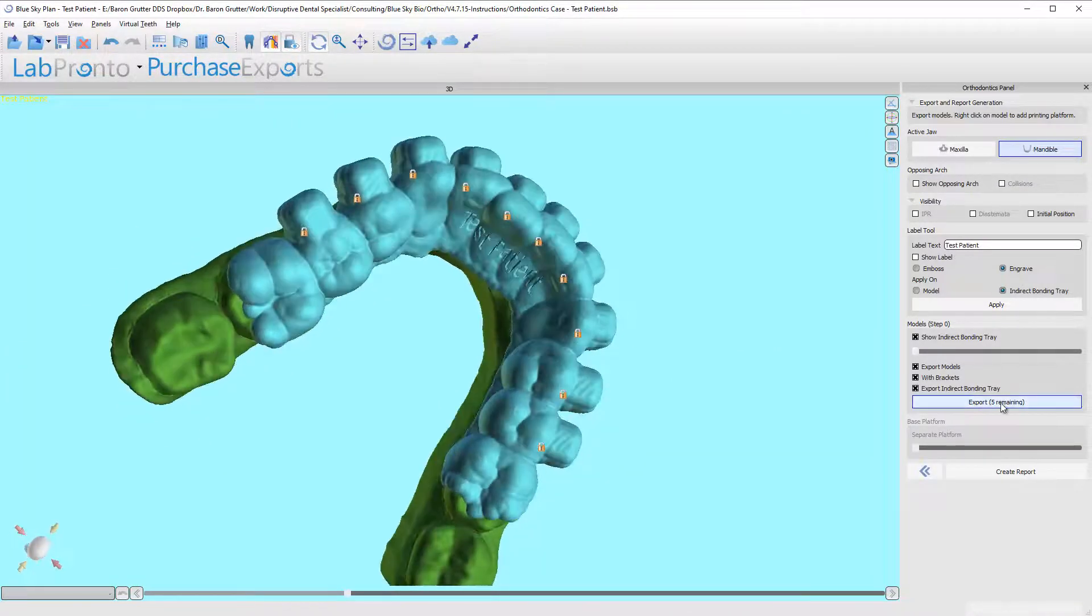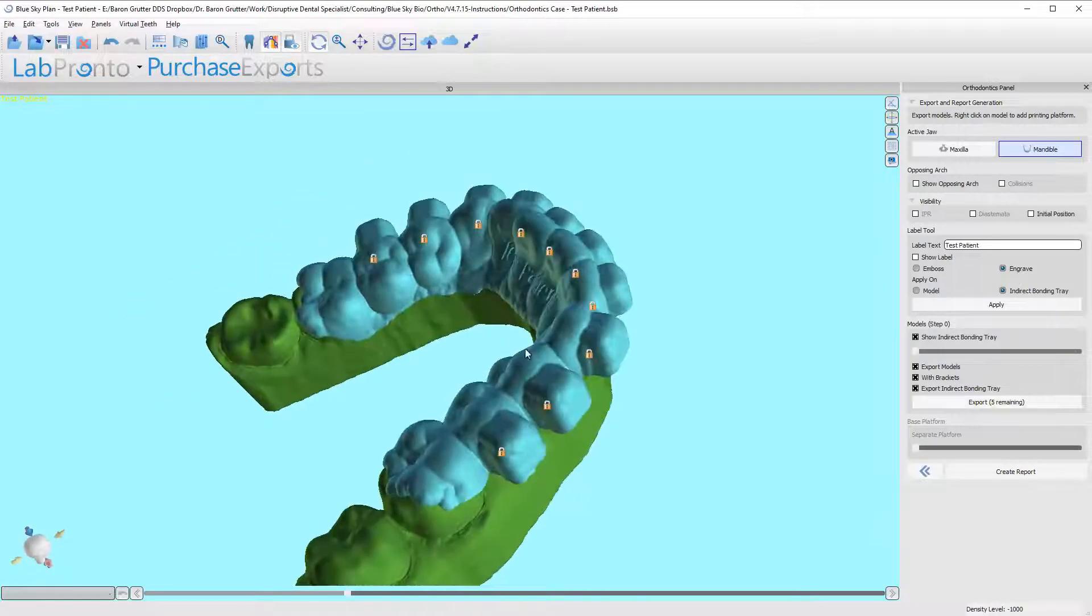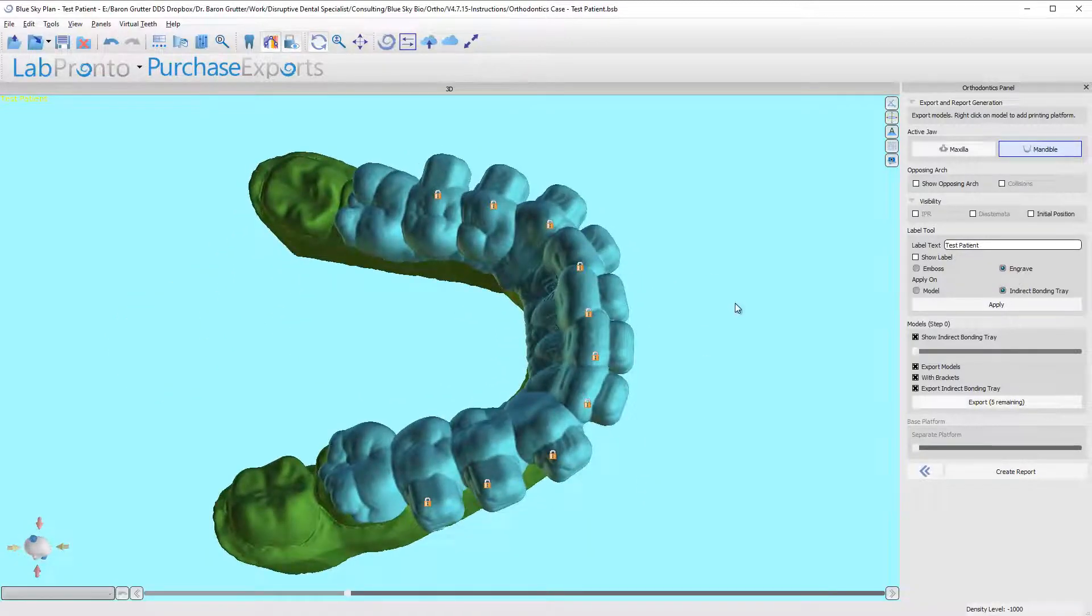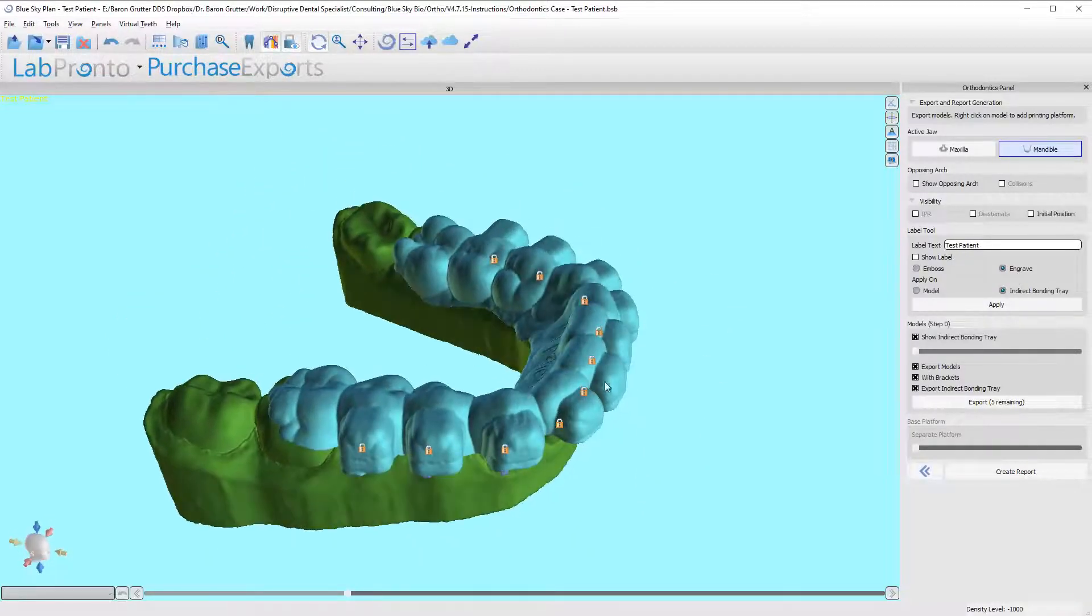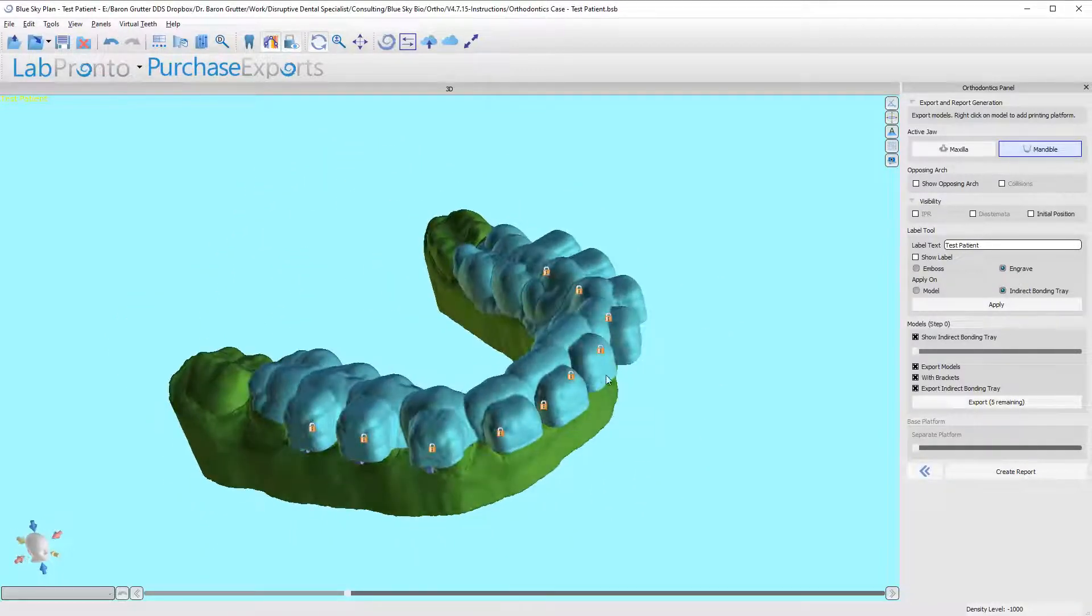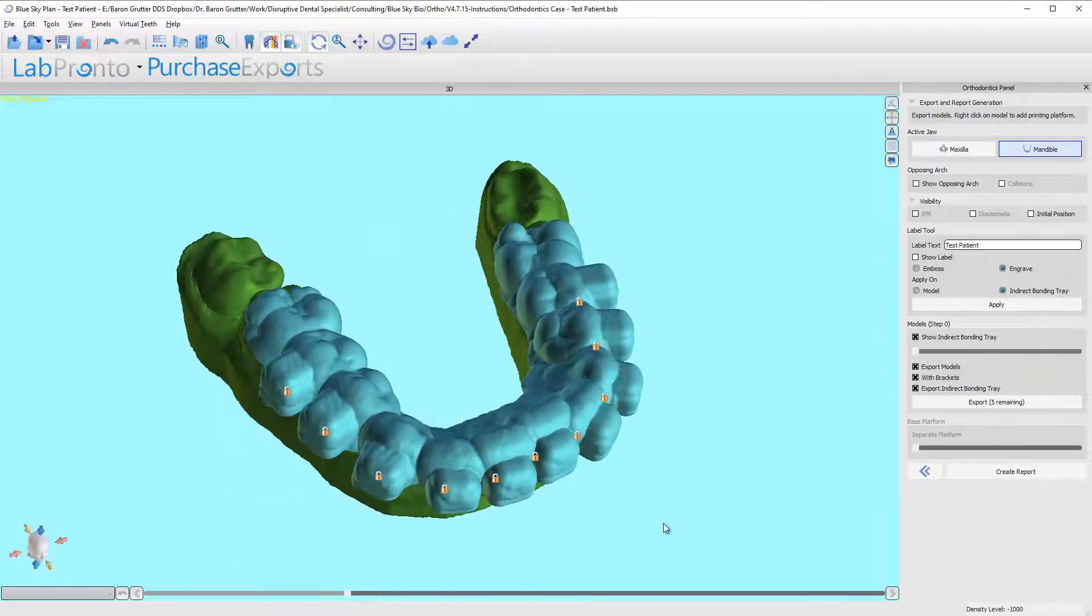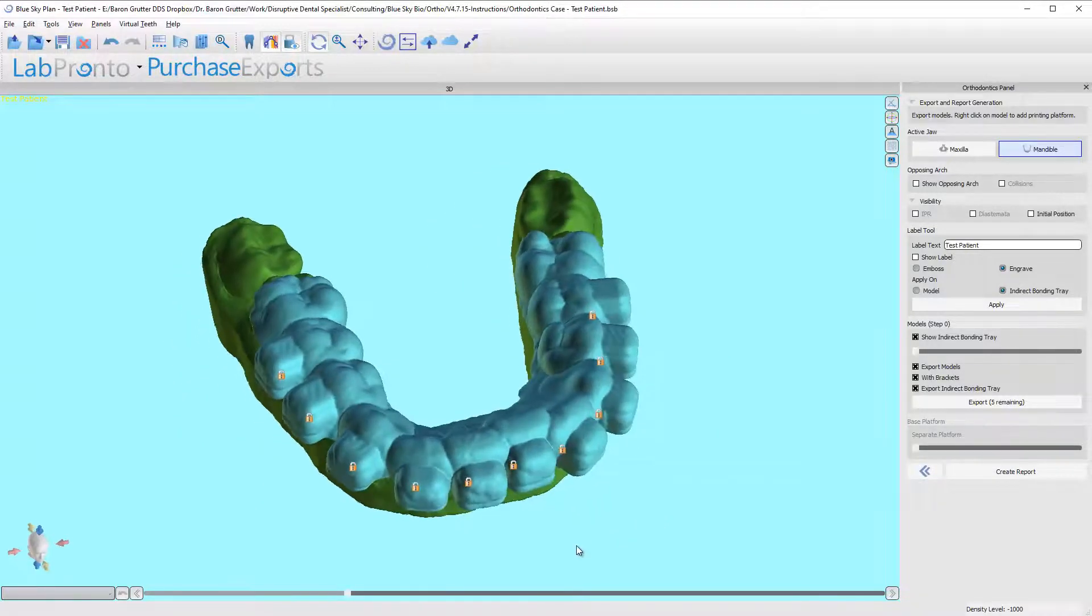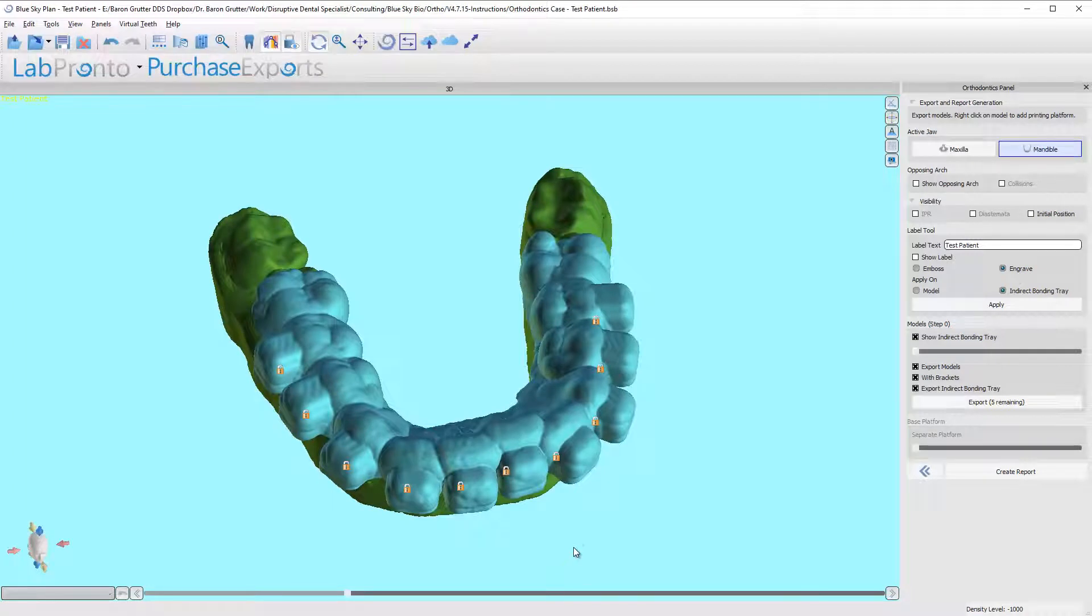So that is it. We can now export our model. It will export all of the models and the tray itself, so it takes a while. Truth be told, you don't need any of the models—maybe the first model as reference and perhaps the last one if you want to have a before and after to present your patient what we're aiming for or for reference as you're moving along through treatment.